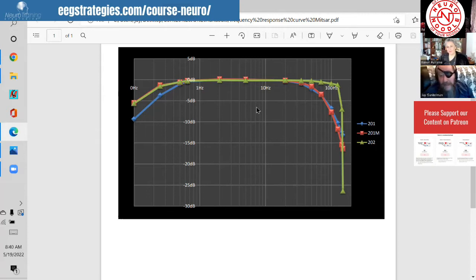And here, let me help you out, Jay. Mind Media, Steve Stern. Anything I've gotten from them. Well, Steve Stern's retired, and Mind Media is basically Nexus amplifiers. And pardon me, Nexus amplifiers were an extraordinarily high quality amp when they were initially built. Others have come up to the same general quality at this point, but they had an actively shielded electrode.